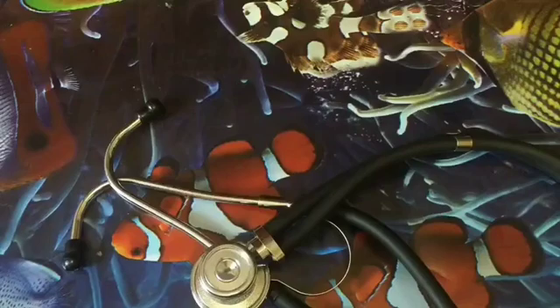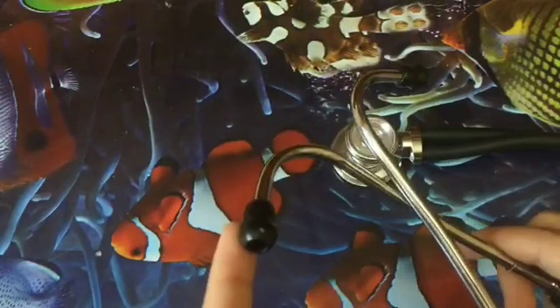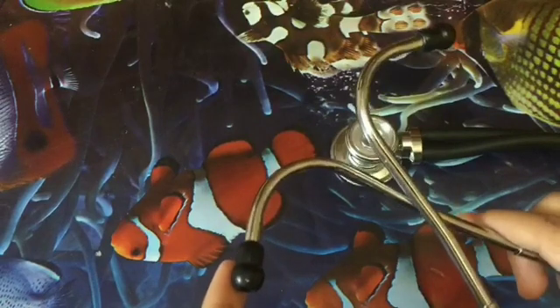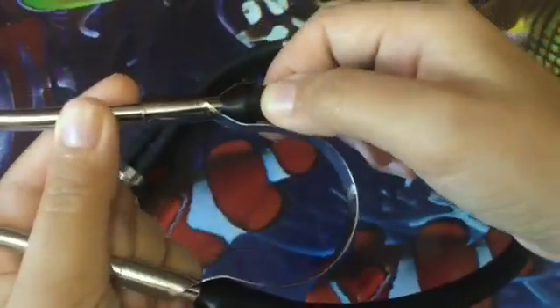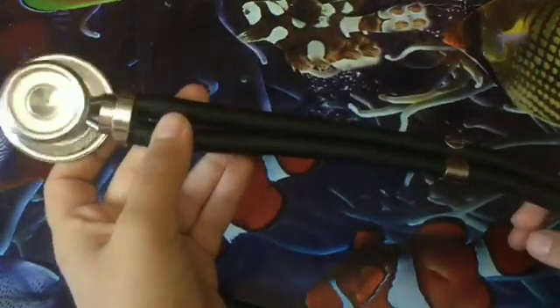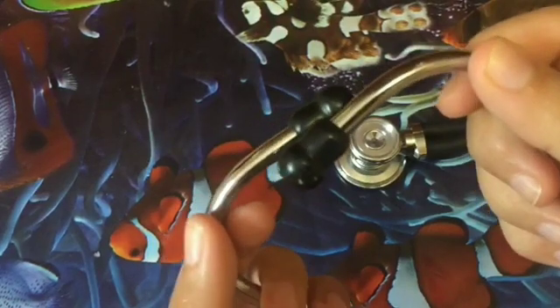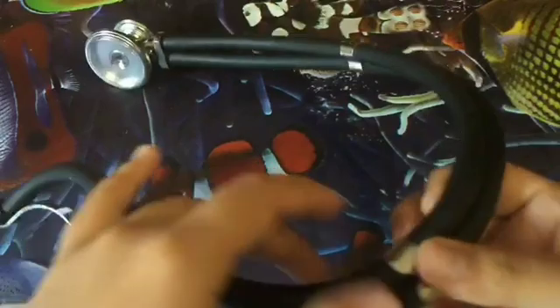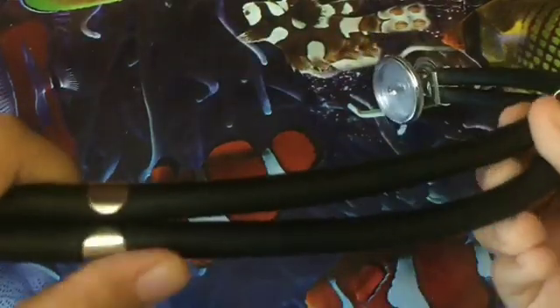First of all, check the stethoscope to ensure top performance. The ear tips should form a tight seal. Check the seals from here and from here. The tips and headset face away from the user. Check for cracks and tears.